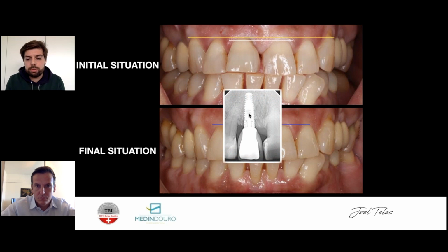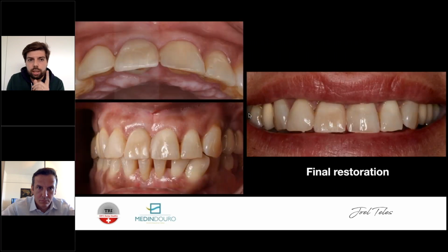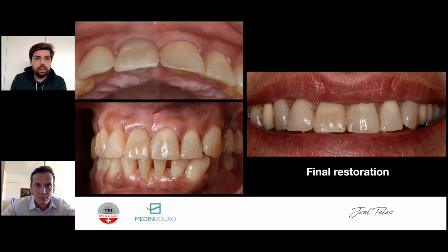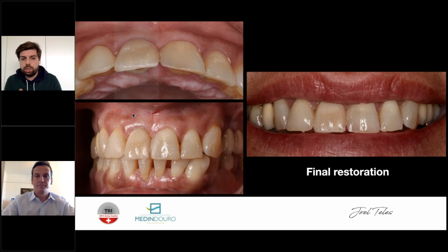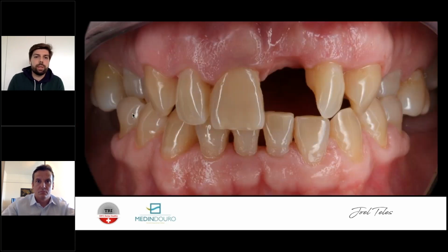And now I'm about to show you the final control I had for this patient. So remember, this is a 2016 case, and this is the control back in 2018, late 2018. Look at the biotype now. It got boosted. It looks thicker. It looks better. And this is all because of the restorative procedures that we have done. This is nothing to do with grafting, okay? Papillas are in place, everything is in place.